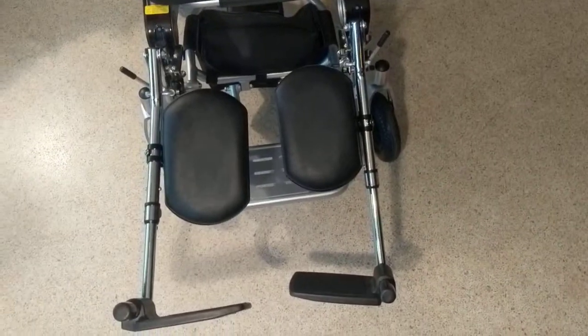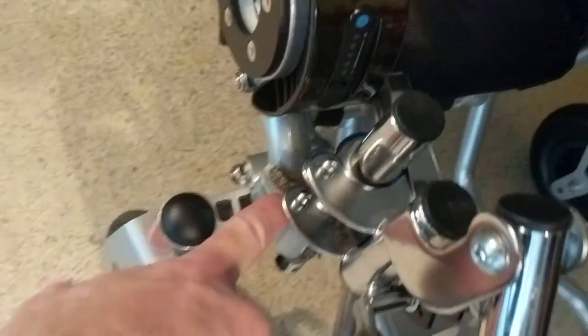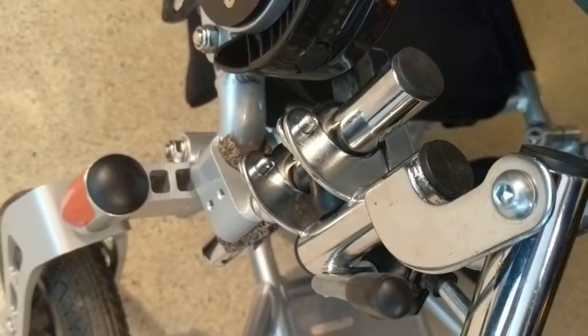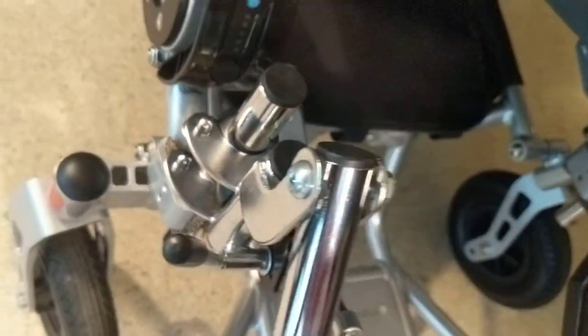Let's recap a couple of things looking at the leg rest from the top. These are always on the outside. I have put my protective material on — for the purpose of this video I didn't tighten it as much as I should have, but it still works. I can't emphasize enough: you can't get this too tight.